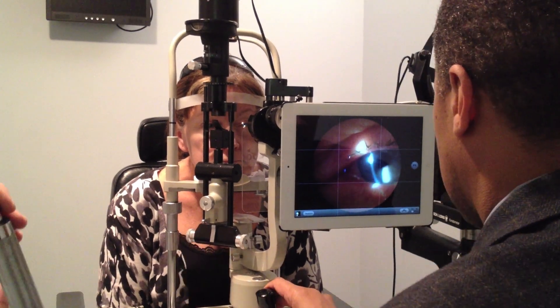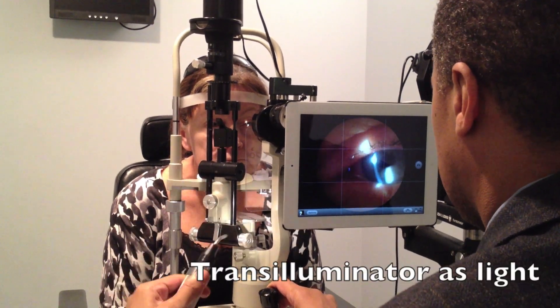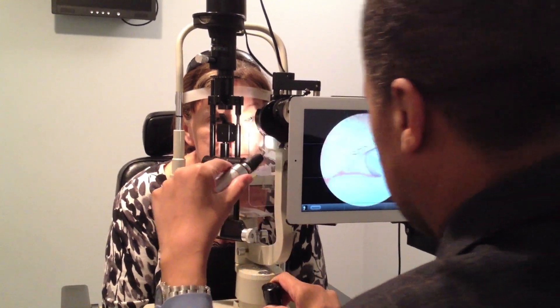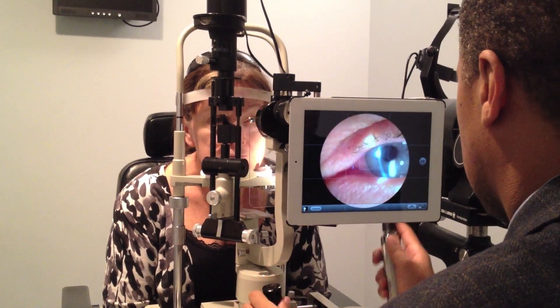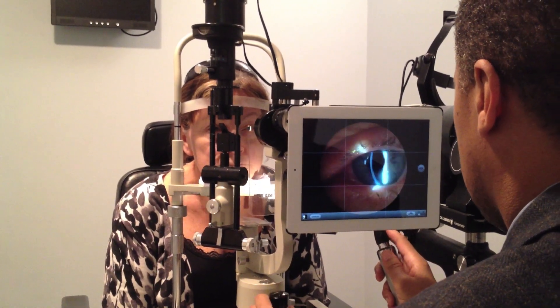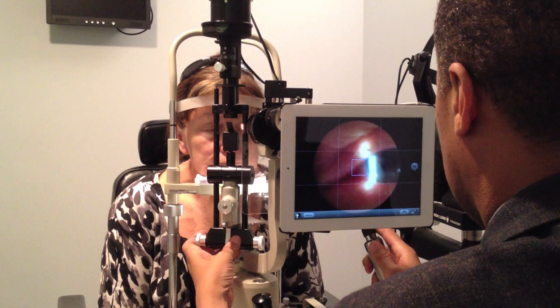I'll hand Steve the transilluminator, and what he'll do is poke it around to see whether he can find an area that will light it up. While he's doing that, he has to move his hands around and move it up and down in order to find the right place.